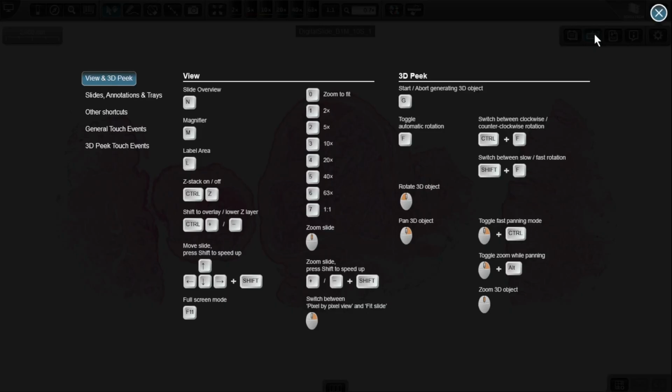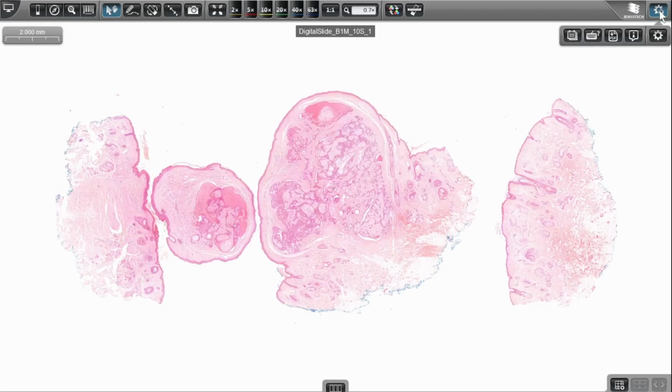We are going to use the usual shortcuts provided by the directional arrows with a shift modifier giving you higher speed in either direction. And also we will map the zoom buttons, which are the plus and minus, with a similar shift button to increase the zoom in and out speed.